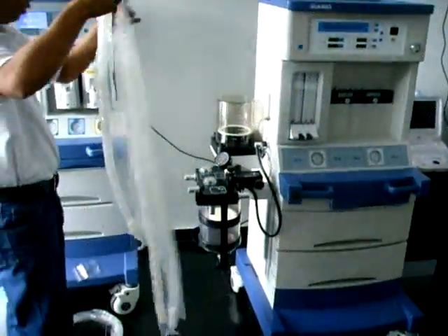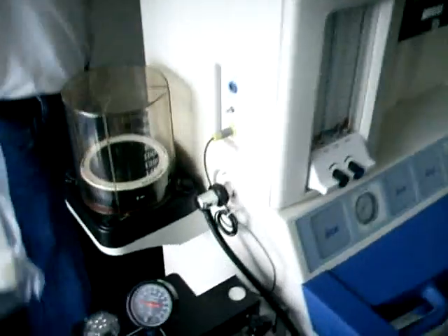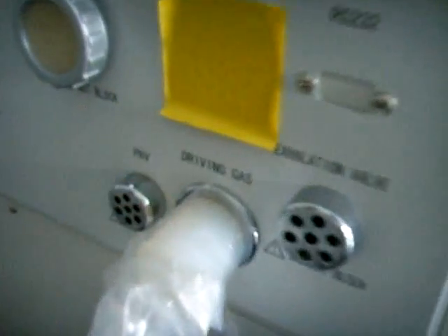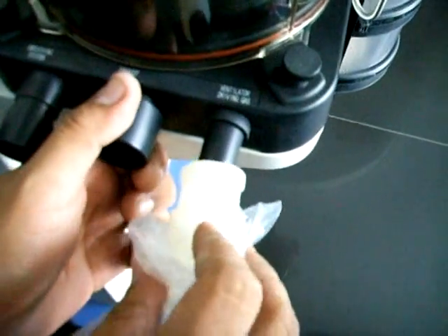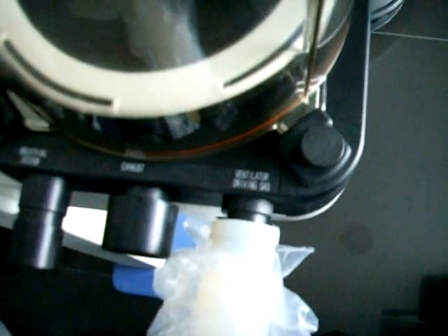Para la instalación de las mangueras identificamos que existen de varios tamaños. Tomamos una de las mangueras y la conectamos en la parte trasera del equipo. La manguera corta: uno de los extremos va conectado en donde dice Driving Gas, y el otro extremo es conectado al fuelle en la terminal que tiene el mismo nombre, Ventilator Driving Gas, como se observa en el video. Esta es la conexión entre el ventilador y el fuelle de la máquina de anestesia.